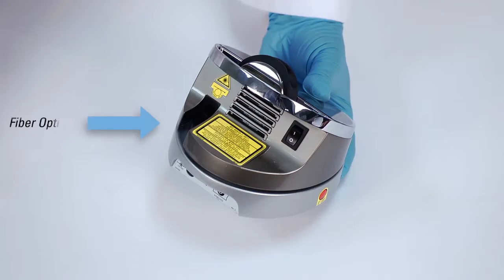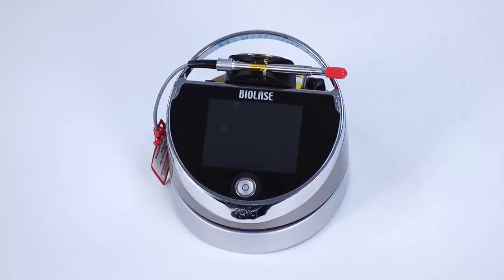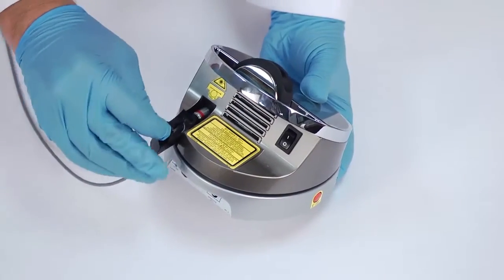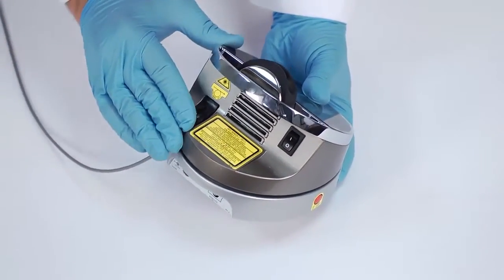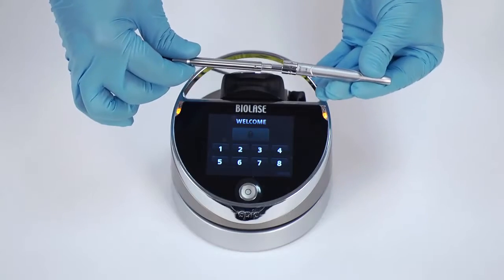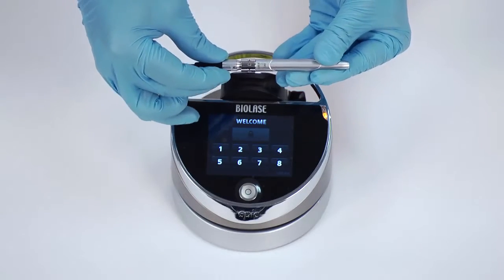Now it is time to connect the fiber optic delivery system to the EPIC. Note that your EPIC system may have shipped with the fiber optic delivery system installed. If not, follow these instructions. Insert the fiber optic assembly into the base of the EPIC unit. Remove protective cap from the end of the fiber shaft. Carefully connect the handpiece to the fiber optic assembly.